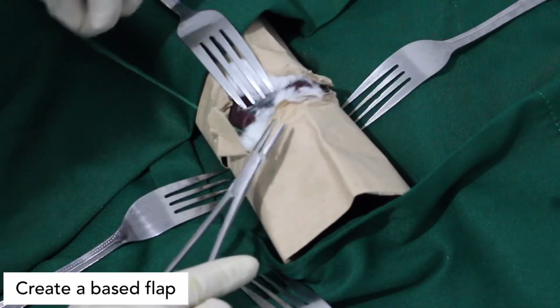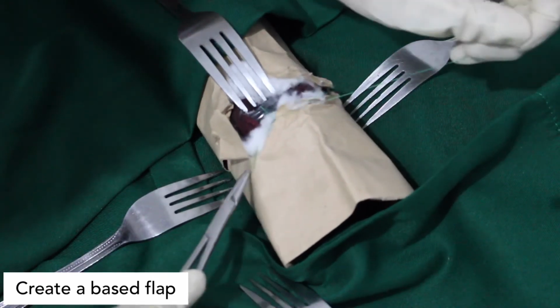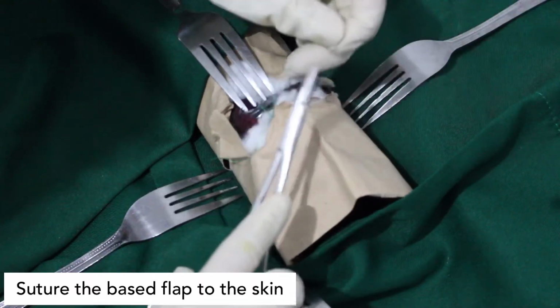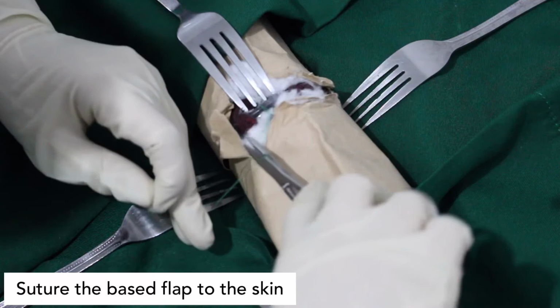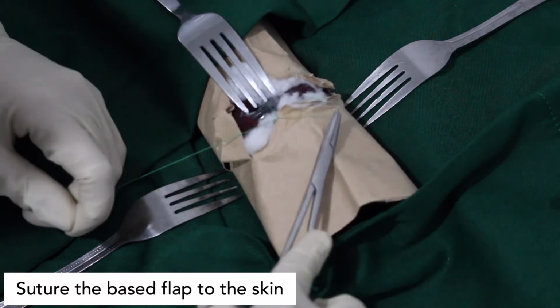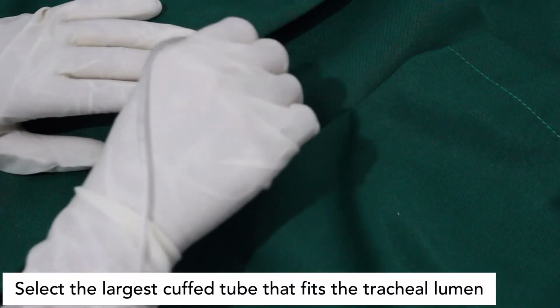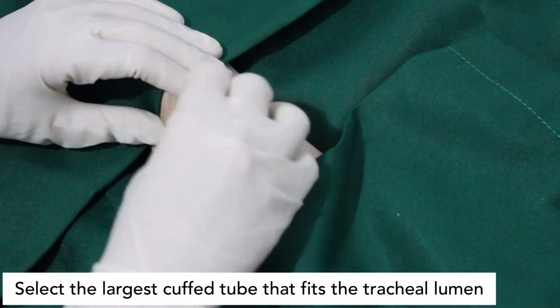Create an inferiorly based flap raised from the anterior wall of the 3rd and 4th tracheal rings. A silk traction suture is passed through this anterior trachea flap and loosely secured to the skin. Assess the size of the trachea and select the largest cuff tracheostomy tube that comfortably fits the tracheal lumen.